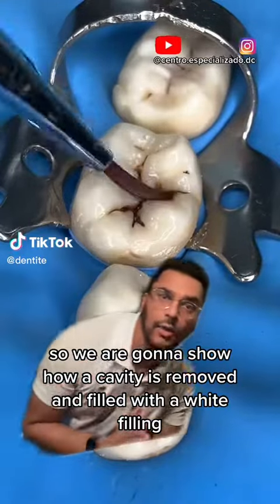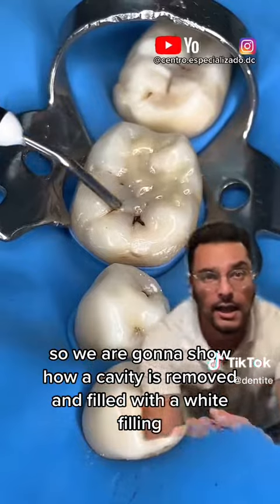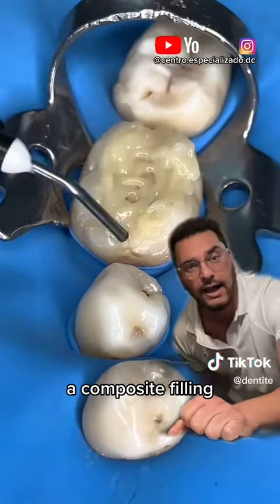All right, guys, so we are going to show how a cavity is removed and filled with a white filling, a composite filling.